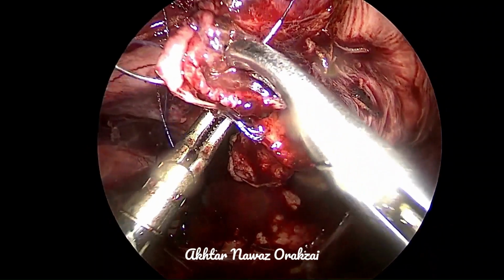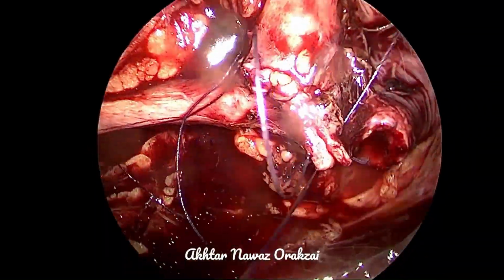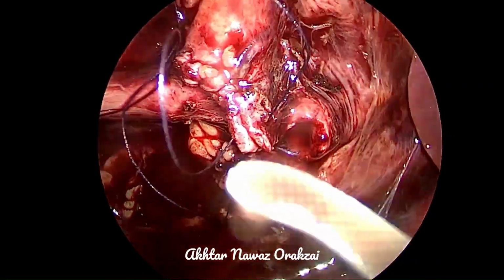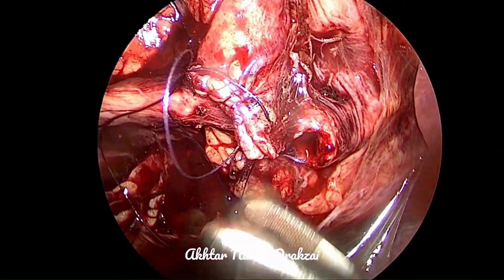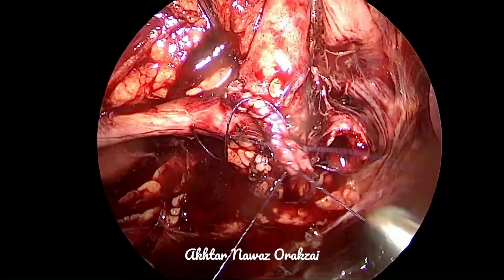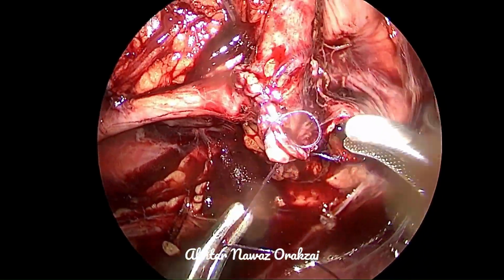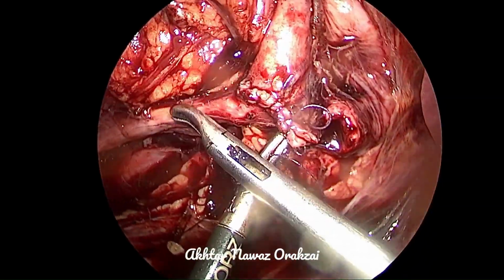However, you can see that we did not excise any segment, but we have addressed that segment just for an extra cautious care that you can see here.